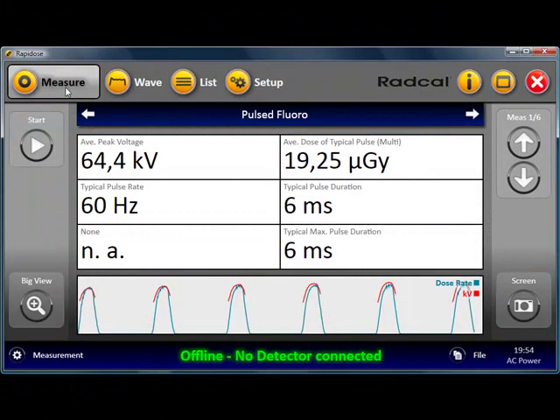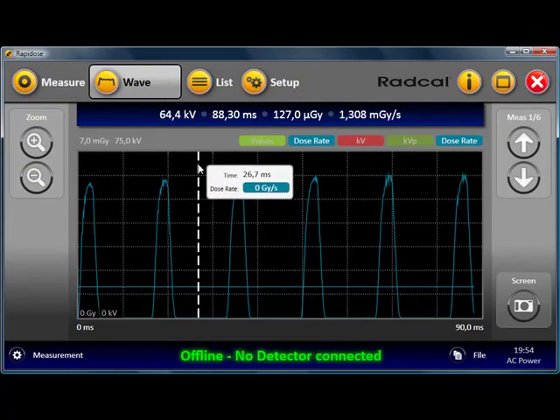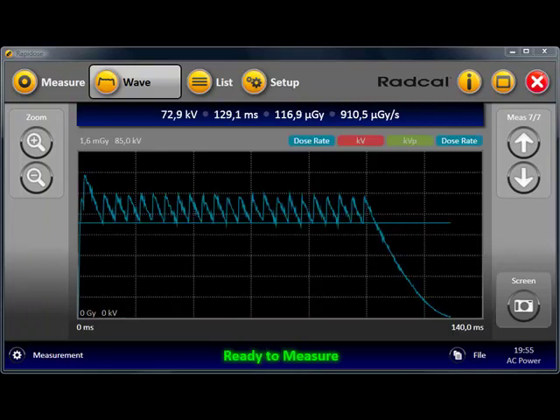I've shown you how to view measured data with Rapidose. But just how do you go about measuring new data? All you need to do is to plug in the USB multimeter and to wait for pairing to complete. You can plug in the USB multimeter at any time. Data you collect is added to the current measurement session you might have loaded into Rapidose.